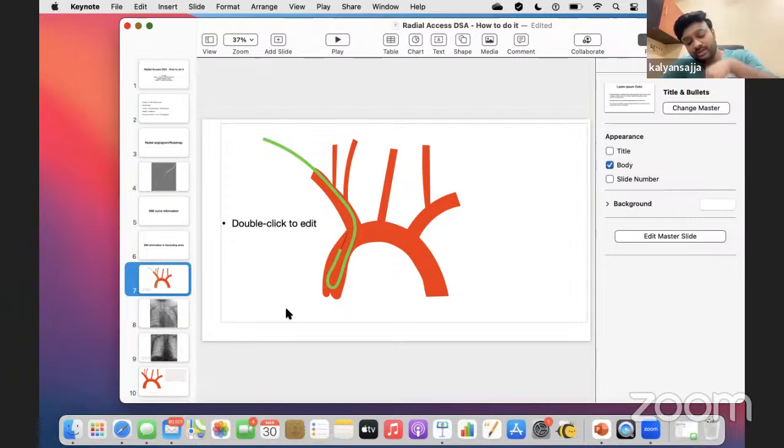In those cases, you can just apply a very tight band and you don't have pseudoaneurysm formations in your snuff box, and the snuff box typically doesn't close. But if you do use a big catheter to go through the snuff box, there is a chance of radial artery occlusion. If you maintain minimal pressure with the patent hemostasis technique on the snuff box, which you can do without a closure device because it's a little bit easier, you would not have issues. You would not have radial artery occlusions.